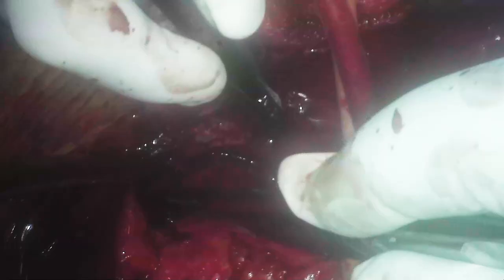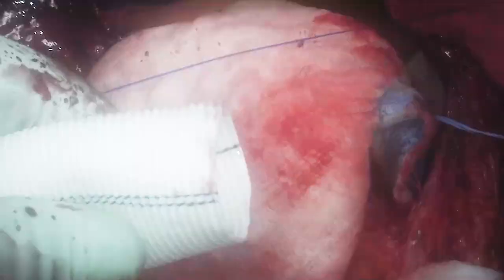We use the right subclavian artery and here you see it's braced to stop collapse. Here's the aortic arch and there you see the proximal composite valve graft. We've got a cardioplegia cannula in position.